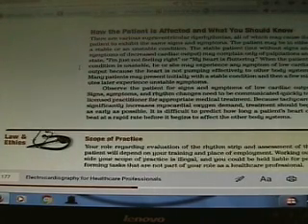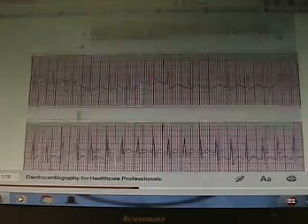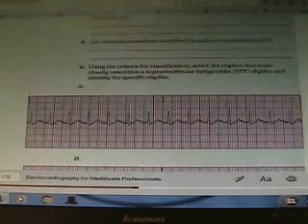Stuff like, I feel palpitations. Palpitations are when you can actually feel your heart beating. That's not good, right? Or my heart is fluttering, or I feel my chest vibrating. And then you put your hand around the fifth intercostal space, midclavicular line, left. Ooh, you'll feel it. And they get unstable really fast. So that's SVT, just like AFib, a very scary trace.